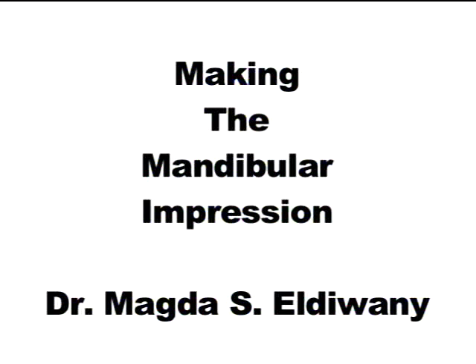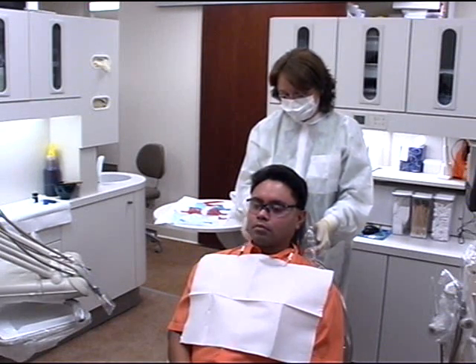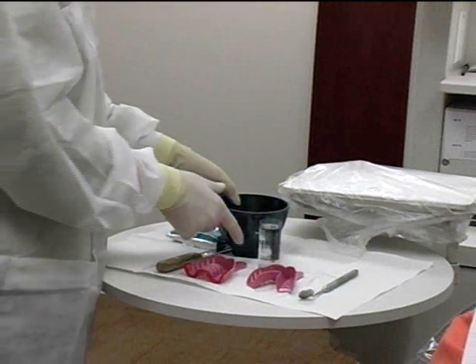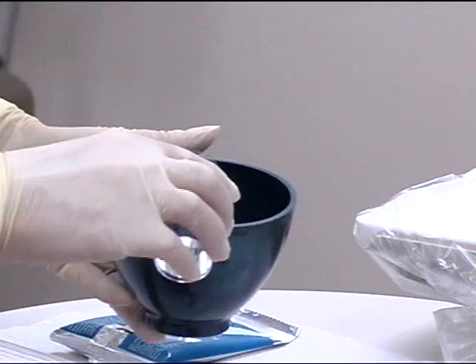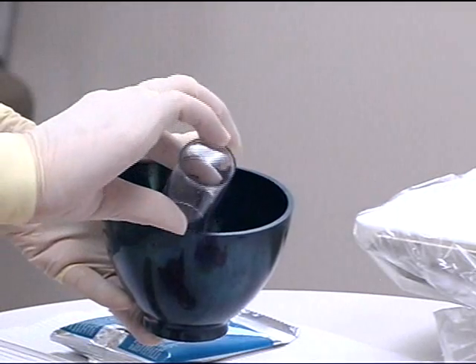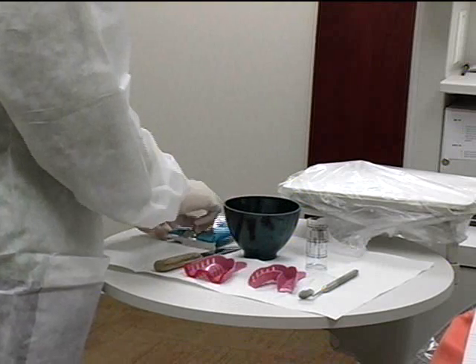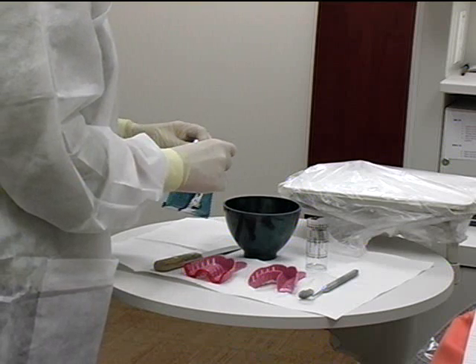Make the mandibular impression first. Patients with viscous saliva should first rinse with mouthwash. Position the patient for maximum operator visibility and patient comfort, and stand in front of the patient to make the mandibular impression. Measure the recommended amount of water into the mixing bowl. Using water at room temperature will give a working time of 2 minutes. Warmer water will result in a faster setting time. Cold water will slow the setting time.